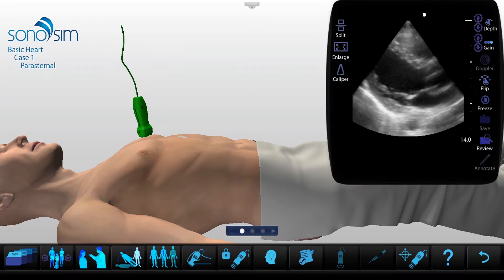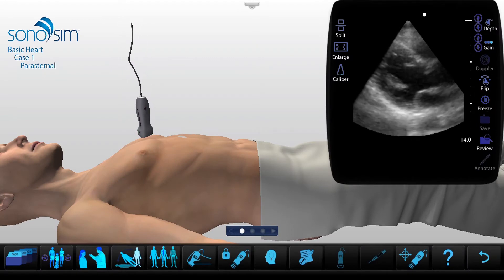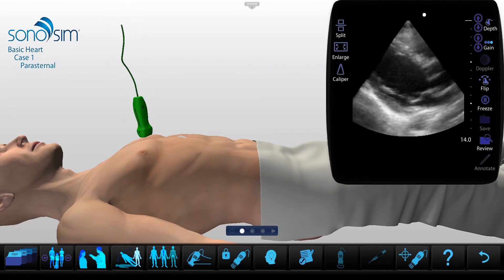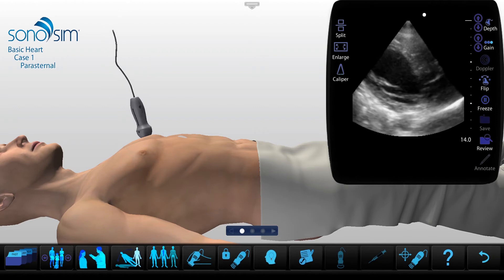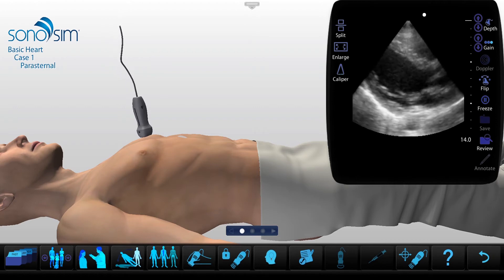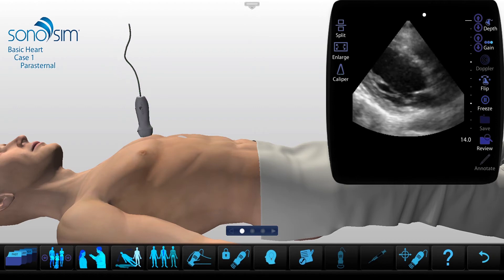Ready to scan virtual patients? The next generation of the Sonosimulator will provide a true scanning experience with the look and feel of a real ultrasound machine.